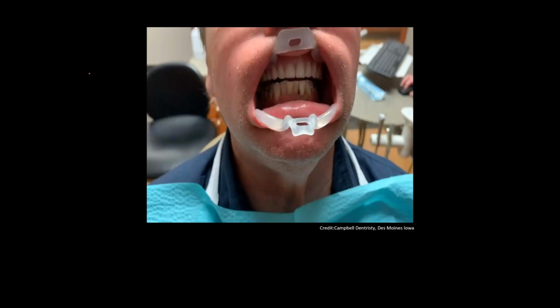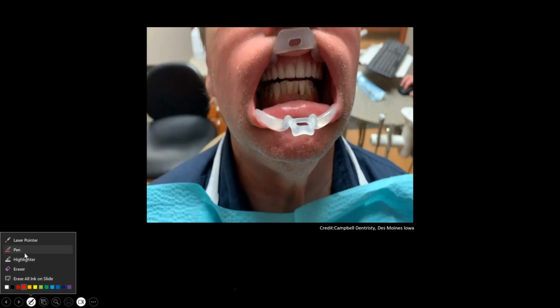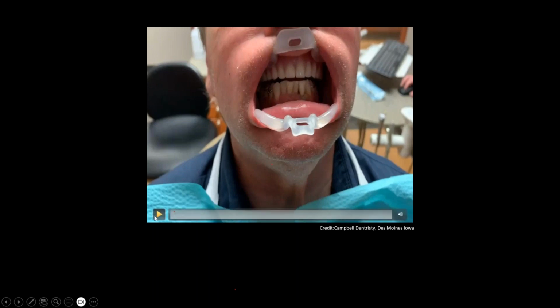Let me show you just a couple quick videos to show my point that the teeth are in the wrong position. This is a video taken from a doctor's office after we chatted about chew cycles. This is a complete upper denture, lower 6 anterior teeth. You can see there's a posterior partial. I want you to watch this patient chew, and then if you can really see it, you'll see the upper denture flex here because the upper's been breaking all the time.